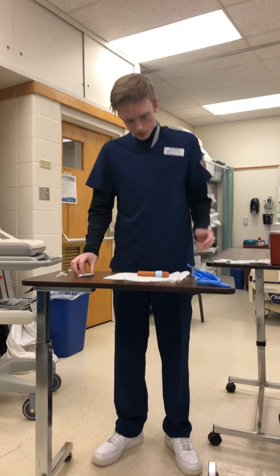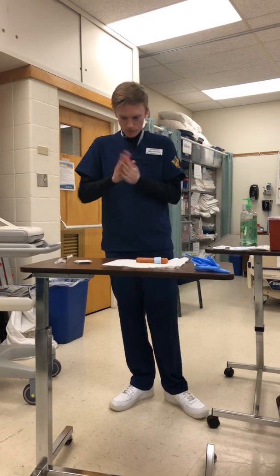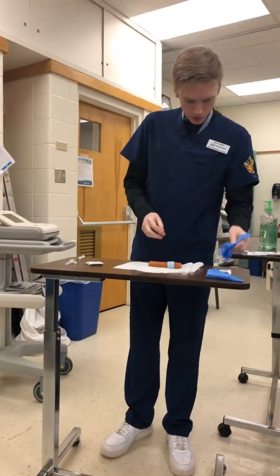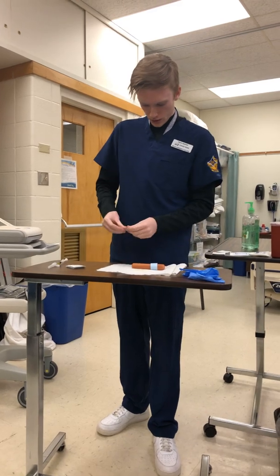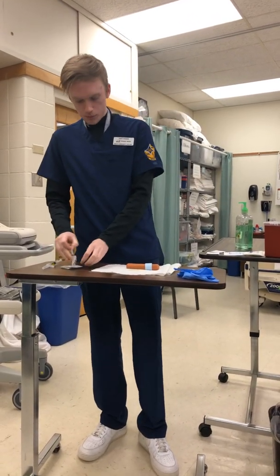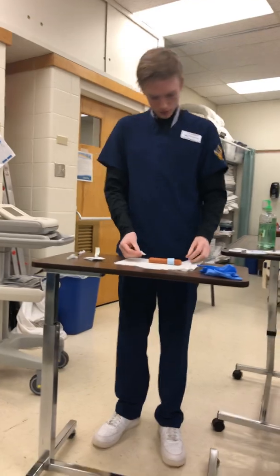So before we start, I'm going to wash my hands. And don my gloves. But before I do that, I'm going to clean the site. And this is when we would place the patient on his side and then identify where to give the injection, as we did earlier on the mannequin.